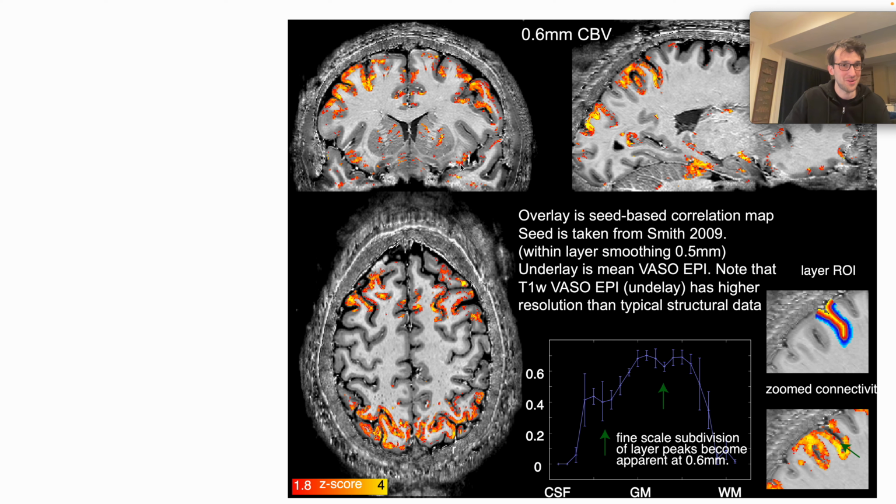And those raw data then also could be transferred to nice connectivity maps, where in some brain areas we do see these additional subdivisions of different layer groups that I could not see at lower spatial resolutions. But overall, I was a bit disappointed.